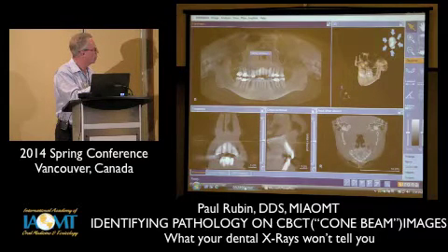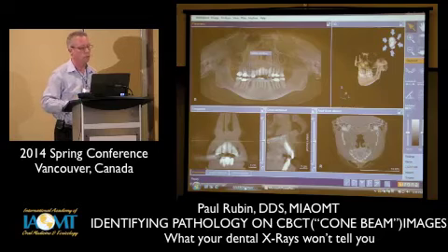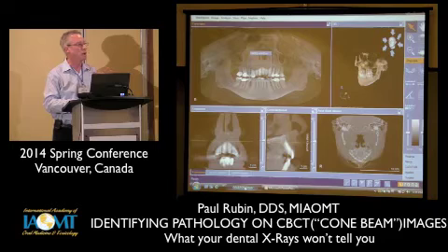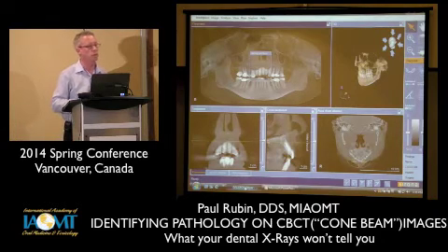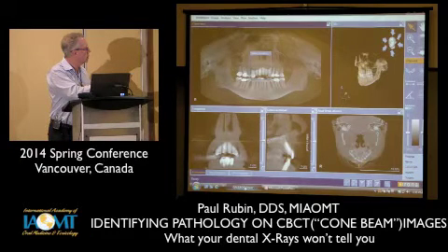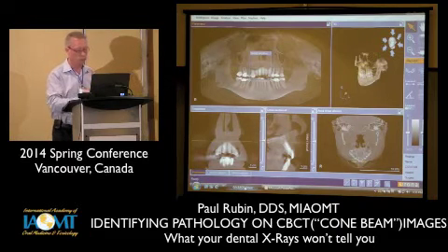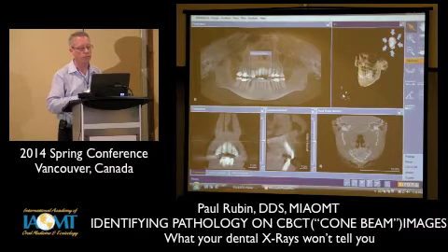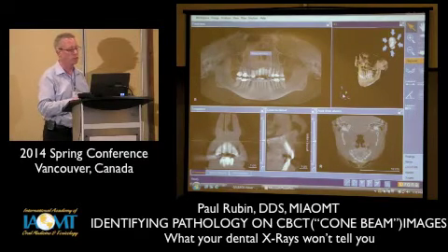So on the upper left part, you'll see a more or less panoramic view. Now you can print this out as a flat panoramic and put it into your chart, into your dental software. On the upper right, you actually see the information that's on this scan in 3 dimensions. You can kind of play with it. I'll go through manipulating it a little bit later.